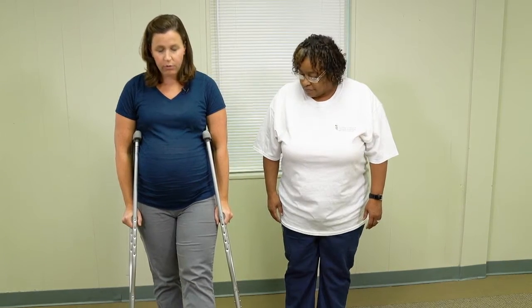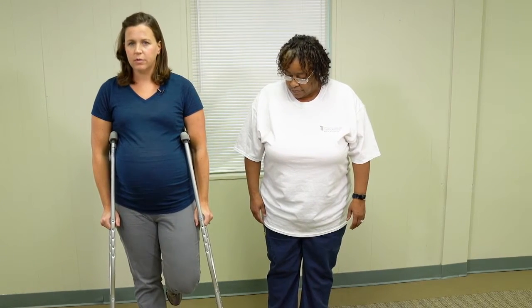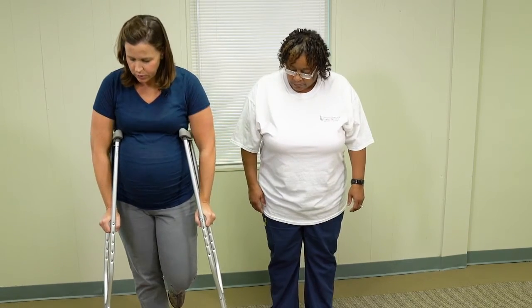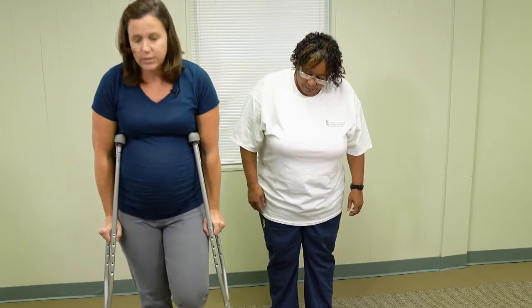If you can't put any weight through your leg, you can either put the leg out in front of you or behind you, whatever's more comfortable. Again, you're going to put the crutches out just a little ways in front of you, really push through the arms, and just take a hop.